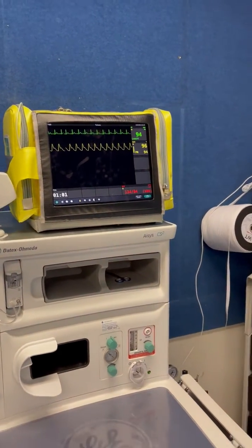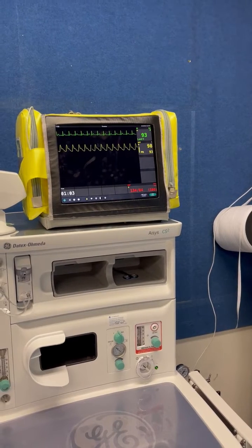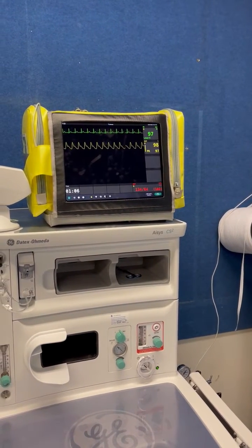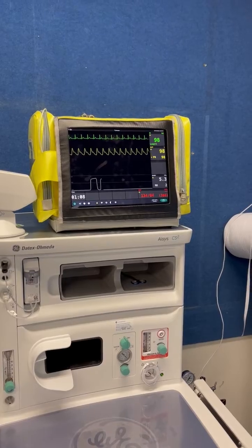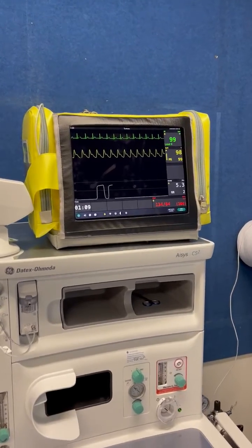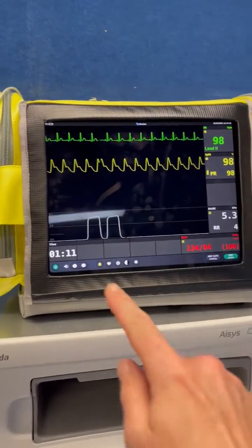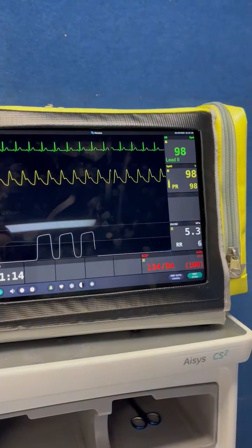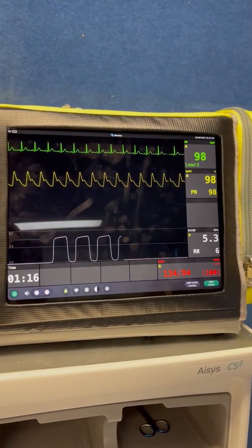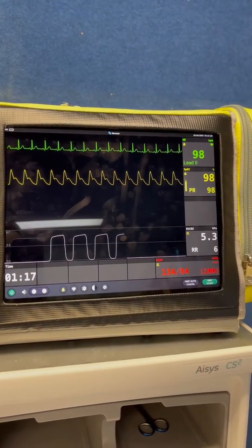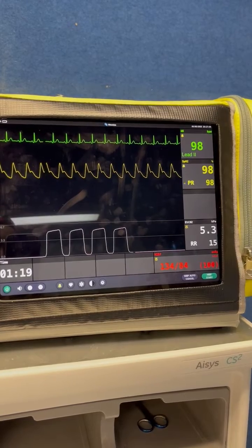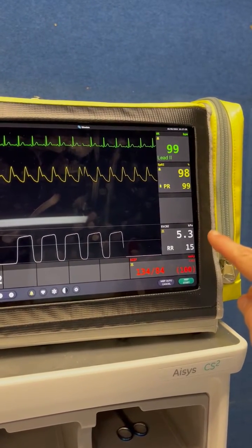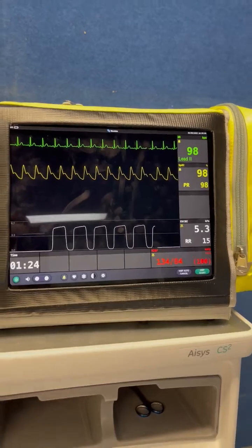When you start to pre-oxygenate your patient, if you have an appropriate head tilt and chin lift, you will see this bottom waveform appear. This is the capnography. The respiratory rate is just building up because it's warming up, but it will tell you the respiratory rate and the patient's expired carbon dioxide level.